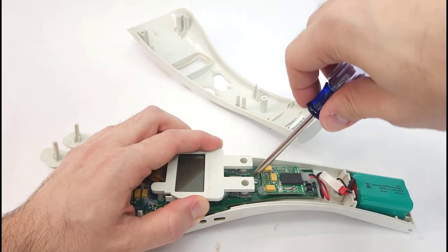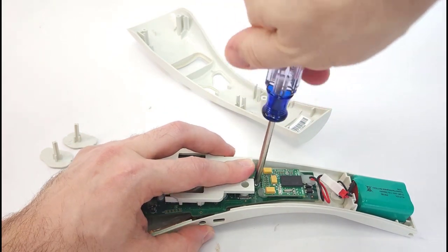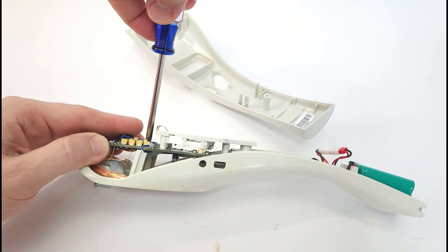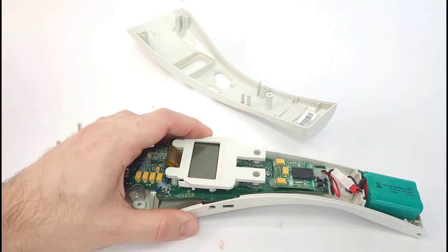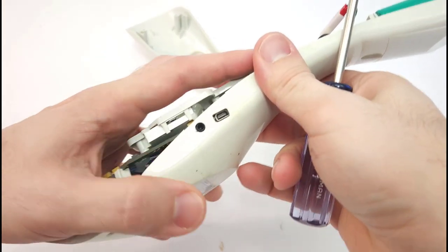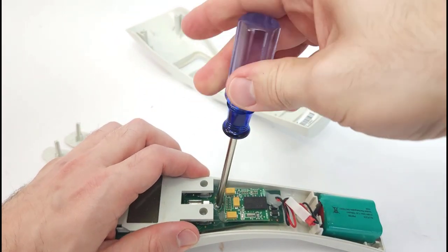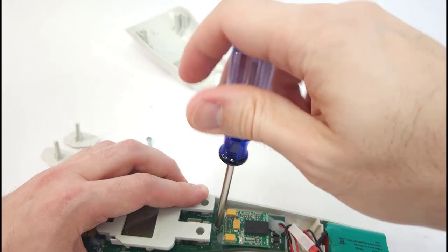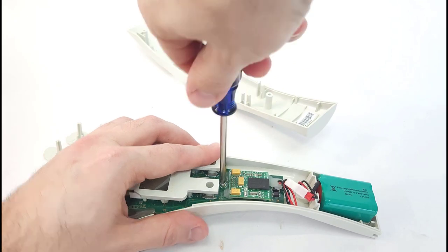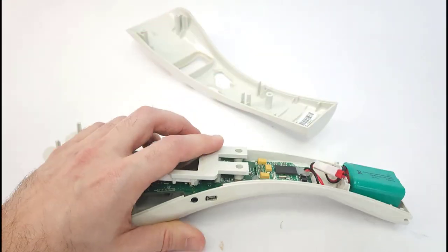Maybe I'll fast forward this part of the video, it might take some fidgeting with the screws to get this pushed into the right place and actually get the screws tightened into the proper holes where they're supposed to be in the plastic. Don't tighten everything down, put the top case back on, and then realize that you don't actually have the ports aligned, because then you're going to have to take it apart and do it again. There we go. You might have heard that snapped into place much better, and now the ports are aligned.